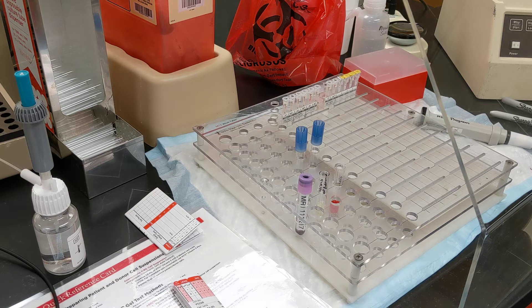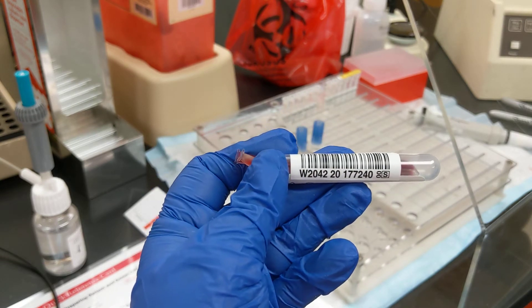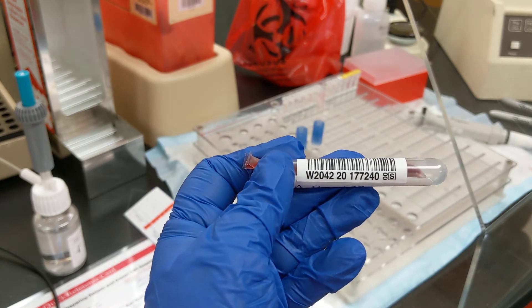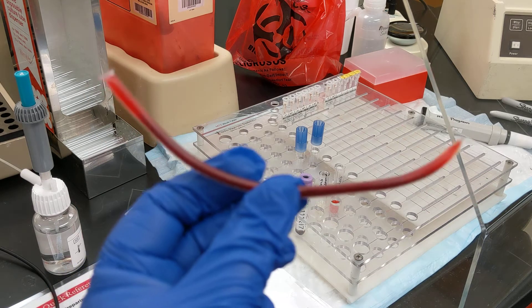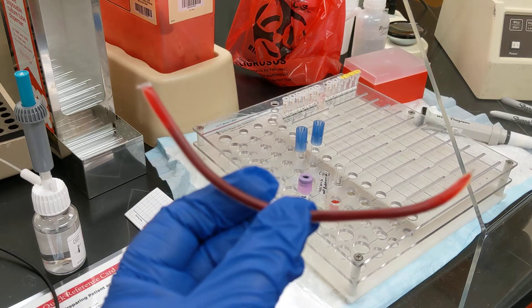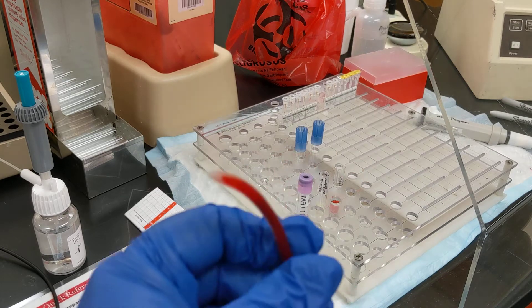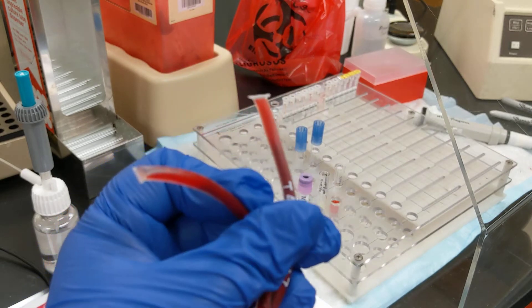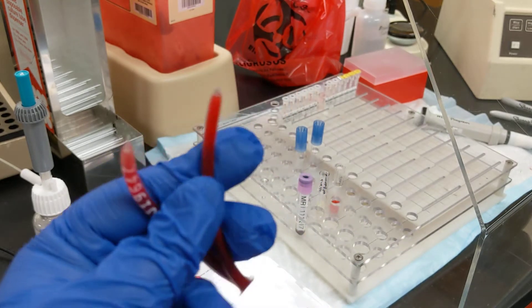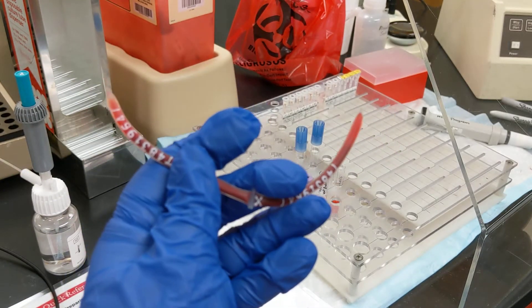We use this device to pierce the segments from Red Cross donor units. When donor units are collected, they have tubing that comes from the needle in your arm into the unit bag, and then they strip it so that the blood goes into the donor unit and back out into the tubing, and now it's anticoagulated. Then they heat seal sections so that we can take it off the unit and use it for testing.